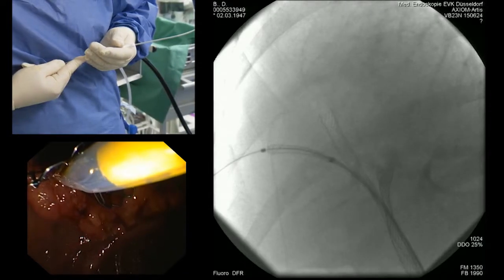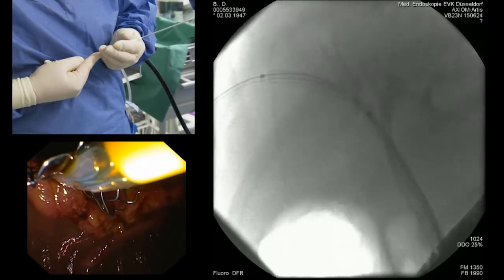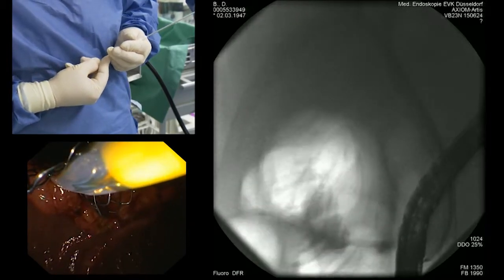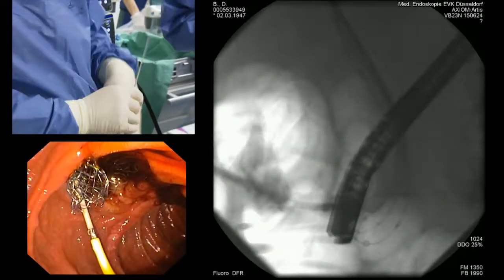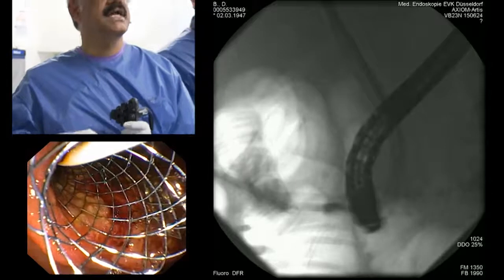I am now looking only at the endoscopy picture. This is very important: the three stents should be placed parallelly, so that when you want to re-cannulate — which is likely in this patient if they live long enough — you will have to re-cannulate all three stents. Now the third stent is deployed — you can see all three stents now. Very nice — Thomas, are you satisfied?